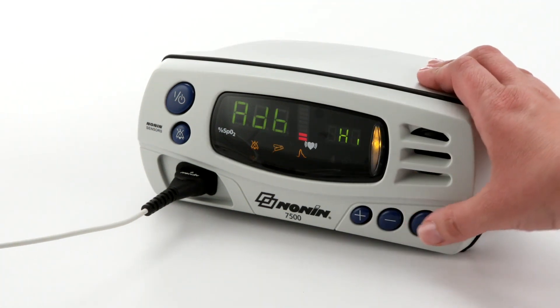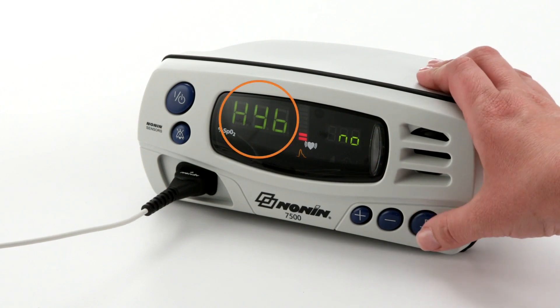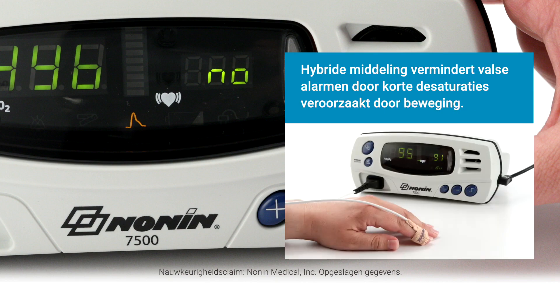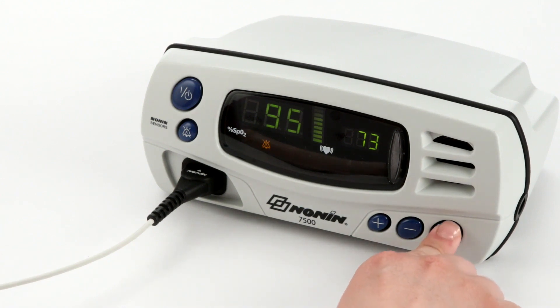The 7500 is equipped with selectable standard fast averaging or hybrid averaging settings. Standard fast averaging is quick to respond to sudden SpO2 value changes. Hybrid averaging has a slower response to a patient's oxygen desaturation, which minimizes sudden SpO2 value changes due to motion and/or other temporary situations. The hybrid averaging setting maintains accuracy while reducing alarms. The default setting of all 7500 models is standard fast averaging.